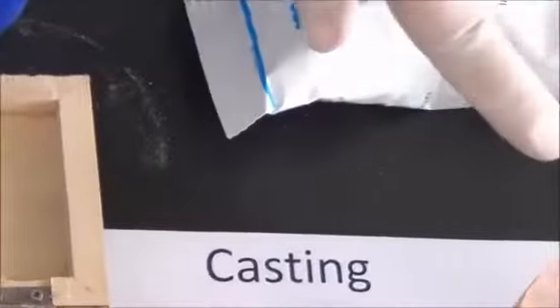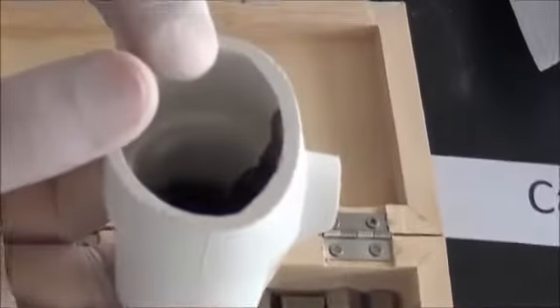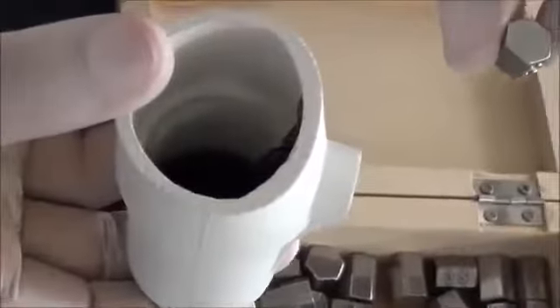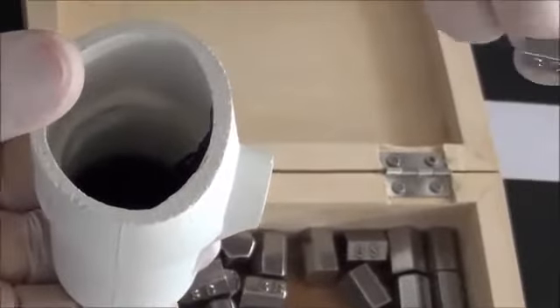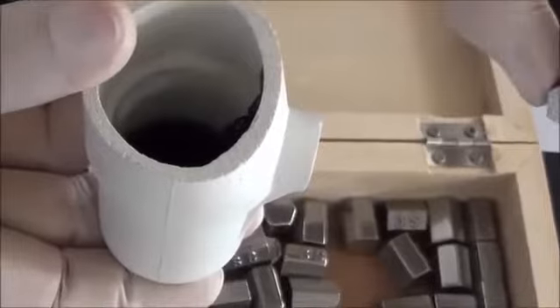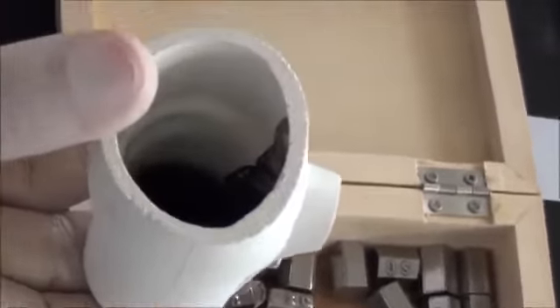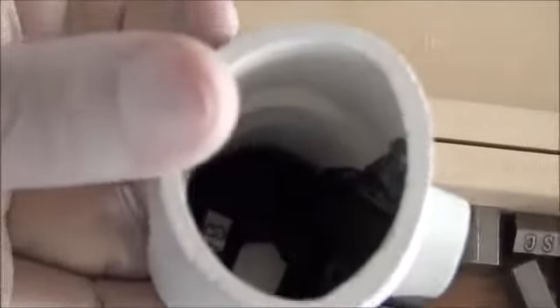There is a place in the casting machine where this is placed and heated. In another part of this casting machine we have the crucible. This will take the metal ingots in. These are the ingots of chrome cobalt material. They come in different shapes. This is one of these shapes. It is placed in this crucible and heated until it's molten.